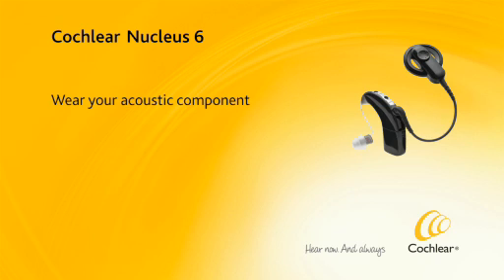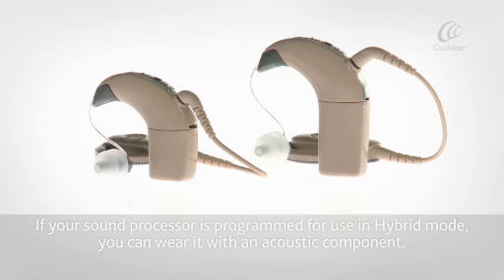Wear your acoustic component. If your sound processor is programmed for use in hybrid mode, you can wear it with an acoustic component.